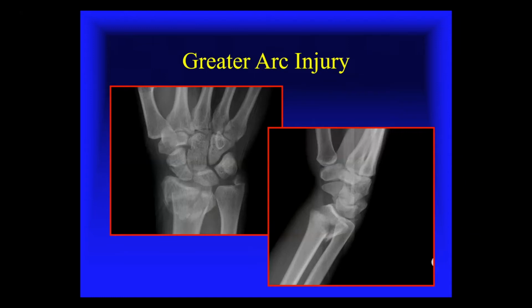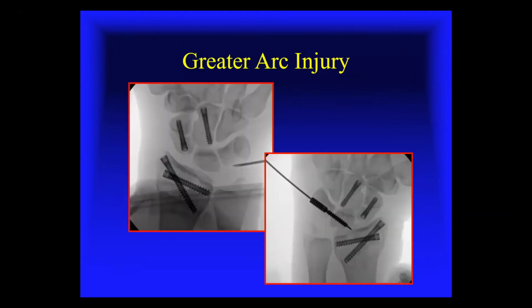So you look at this, we had a scaphoid fracture. Obviously, we had the distal radius. There's a capitate fracture, and there was some instability to the lunotriquetral. So arthroscopically, we came across and fixed the distal radius. Arthroscopically, we fixed the scaphoid. Percutaneously, we fixed the capitate, and then placed a screw across the lunotriquetral.